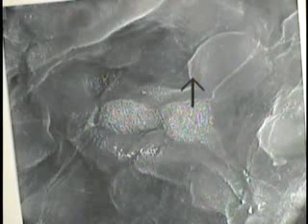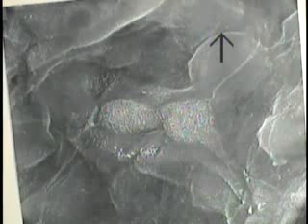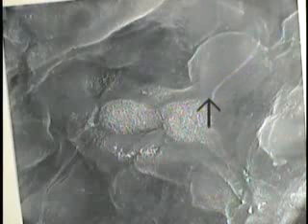Yet this wall is so thin you can see the outline of the erythrocyte, as indicated by the arrow, coursing along within the alveolar wall, but yet within the confines of a capillary. So I think it illustrates quite dramatically the thinness of this epithelial wall. Once again, this is the junction between two type 1 pneumocytes.